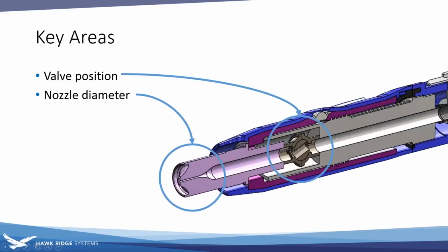And there's going to be a couple of key areas that we're going to want to monitor. The valve position might play a part in the amount of back pressure that's generated, and we're also concerned about what type of flow patterns are developed downstream of the valve and if that's going to interact with the actual nozzle itself. And then the key variable that we're going to be playing around with trying to tweak our design is going to be the nozzle diameter in order to get the proper behavior out of this tool.